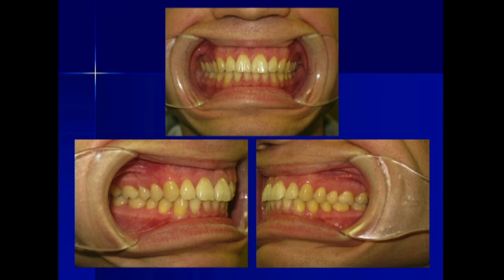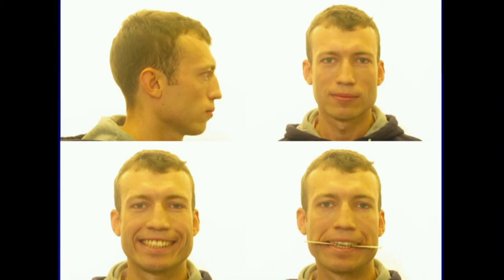I possibly do that. Yeah, but whenever the case, this is quite an easy case. If I need to, for instance, do segments and stuff like that, I'll certainly today go 3D. I'll go with the scans. But this is not a very difficult case, because it's the nice thing about it. He's got a fantastic occlusion. His occlusion is my guide. I just take that. Remember my triangles.